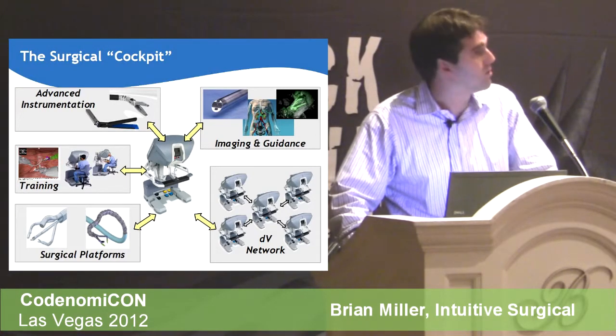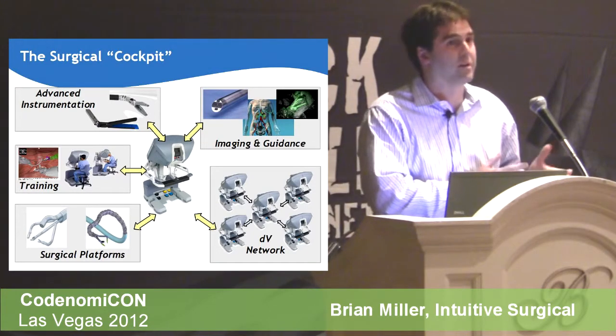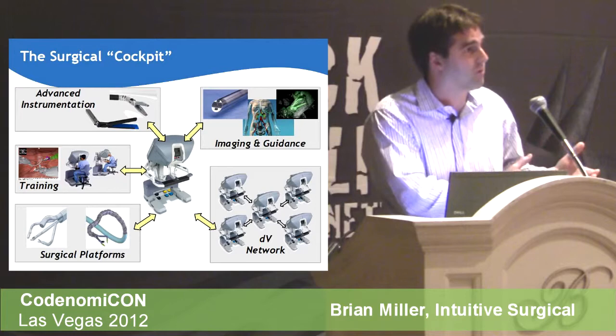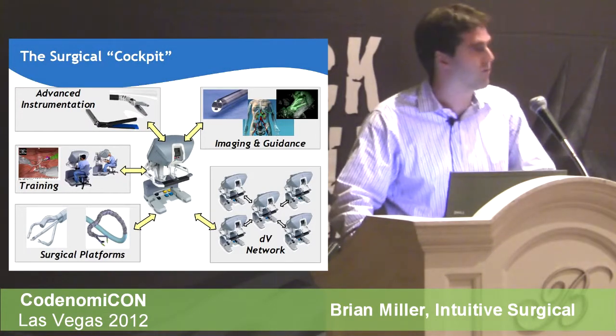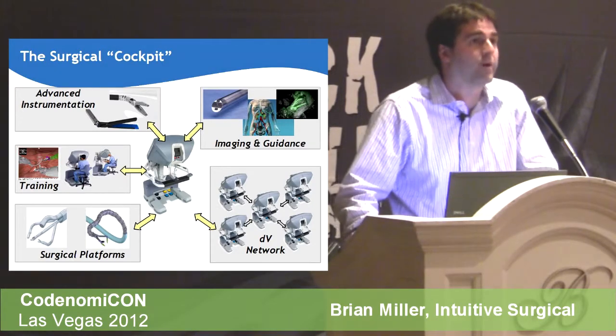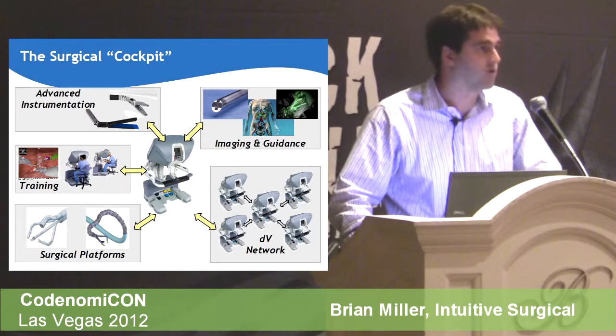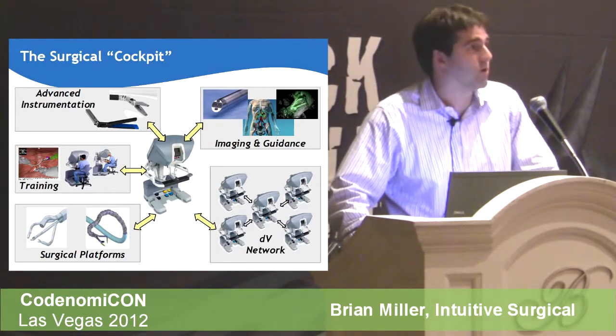And so we really look at it all the way from design, in isolating that functionality onto separate hardware, into separate software processes, so that we can isolate the exposure for any sort of issue that may occur, so that the rest of the system can operate and drive the robots, and all the control systems that are on there can function in a different space. So that's really our primary mode.